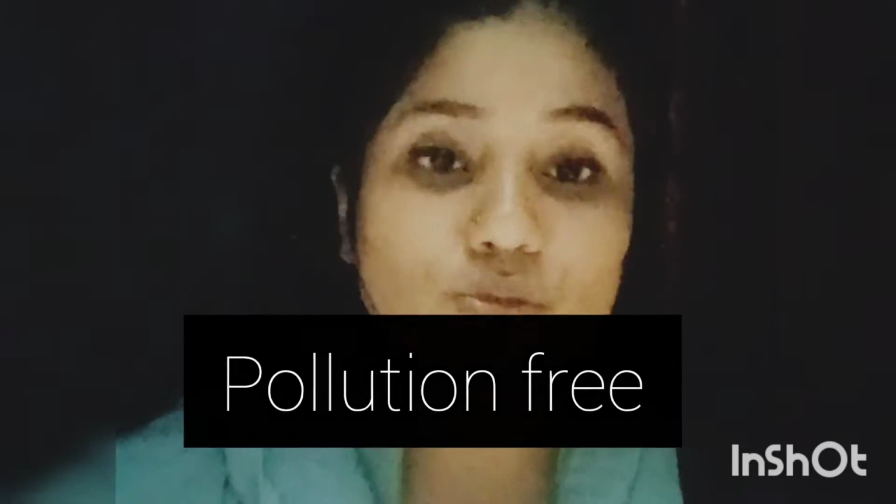So let's go through some deep points. Already told the introduction of gas plasma. Plasma is the fourth state of matter and it contains positively and negatively charged ion particles. It is an ionized gas and can be categorized into two types: high temperature and low temperature. In this method we are using only the low temperature sterilization method, because we are sterilizing instruments that cannot withstand high temperatures.